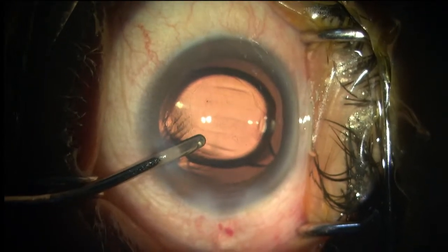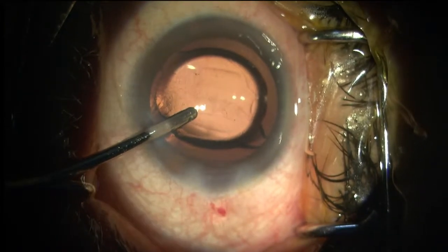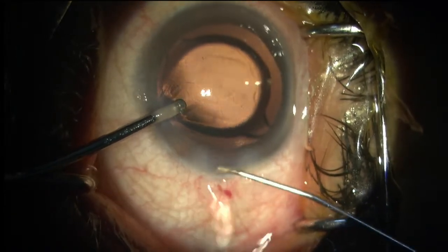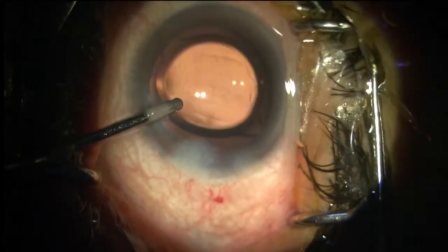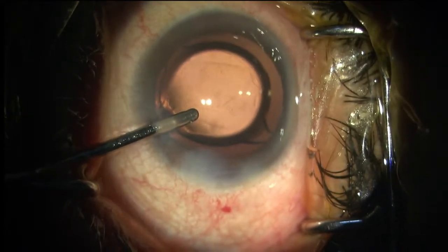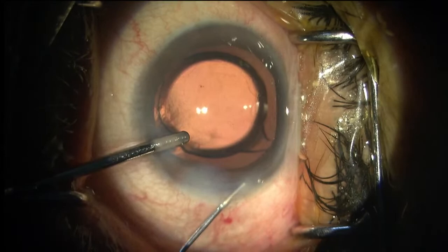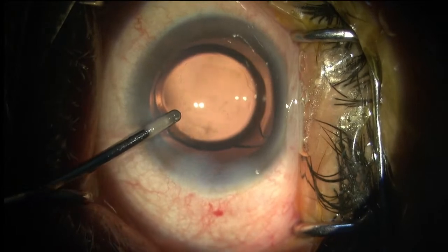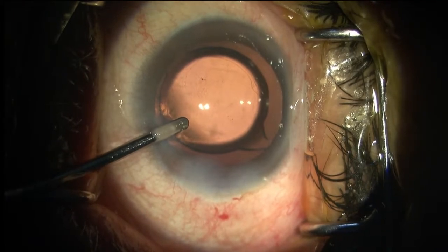Hydration, take it. Bottle height, reduce it. Yeah, yeah. No, this is only the patient's. Yeah, lower the bottle height, please, to 50 centimeters.